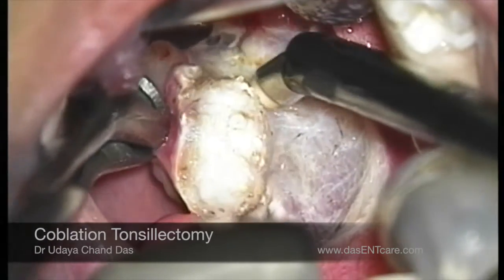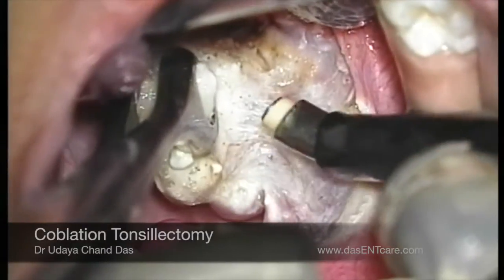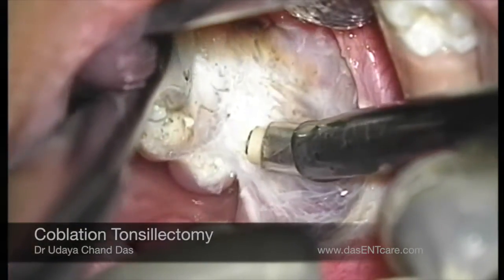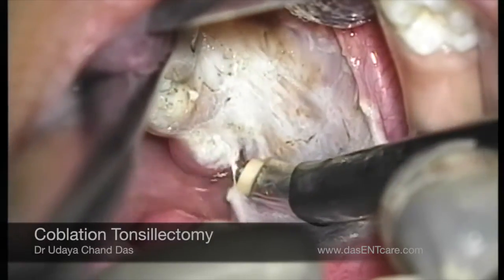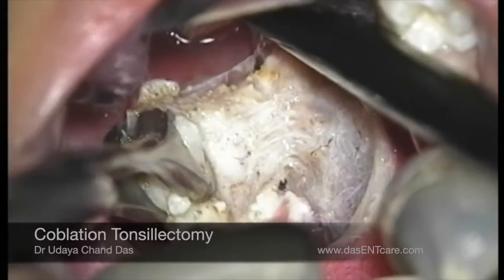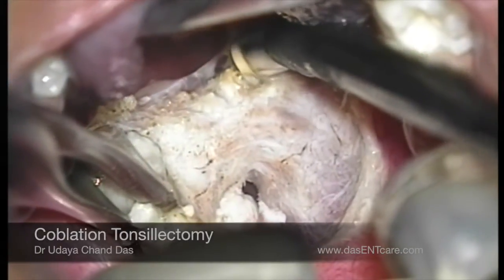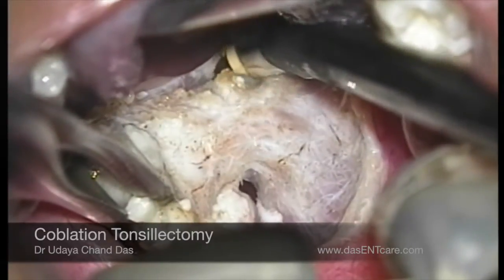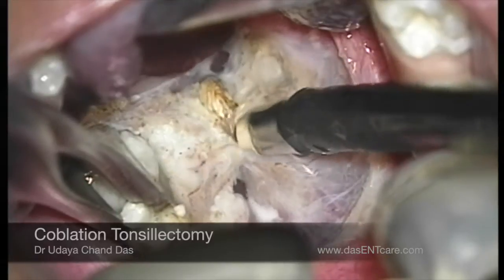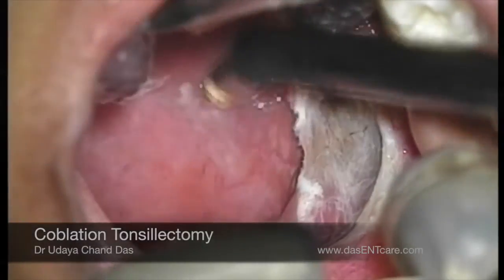That's why you can see the surgery is almost absolutely bloodless. With the microscope, I am able to see the capsule and differentiate the capsule of the tonsil from the deeper tissues — the muscle layer — so the muscles are not damaged at all. I can do my dissection exactly along the capsule using this coblation and microscope.